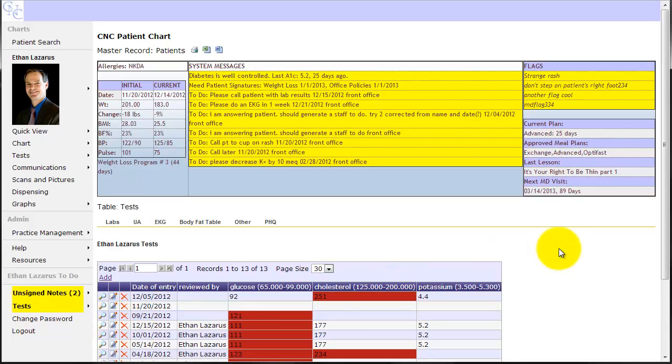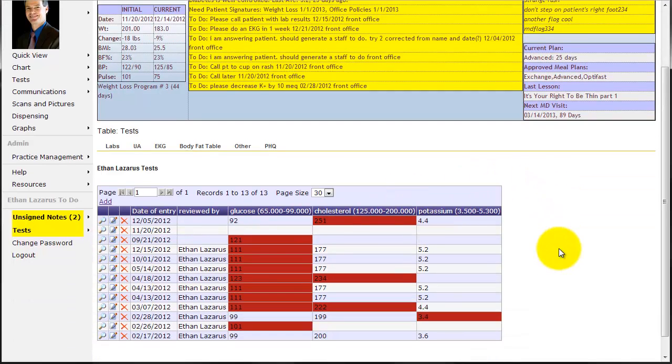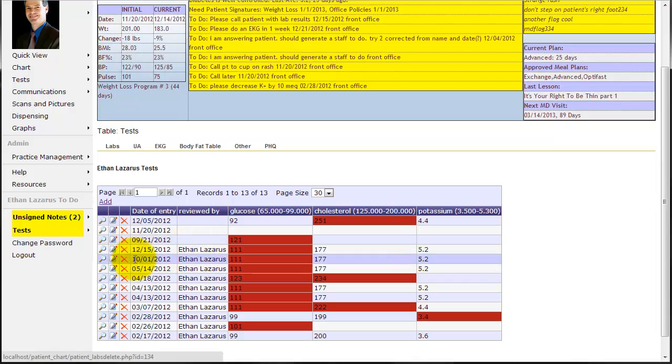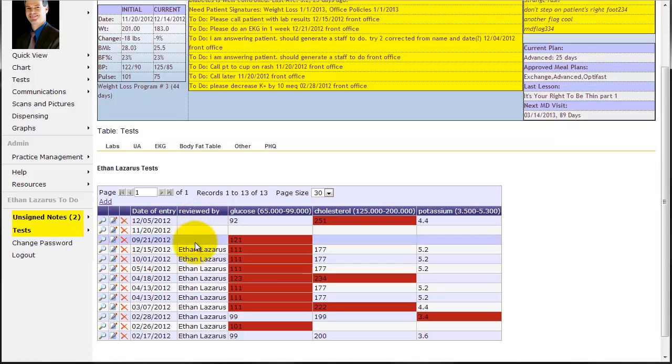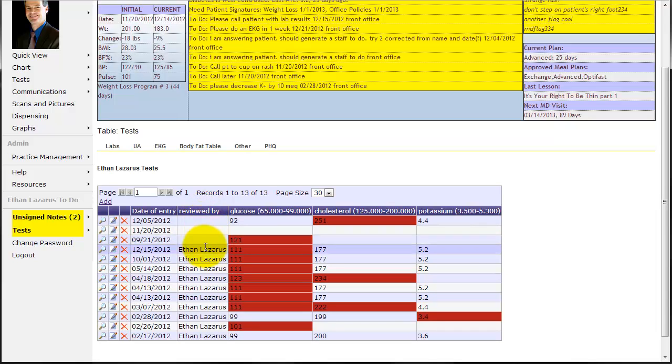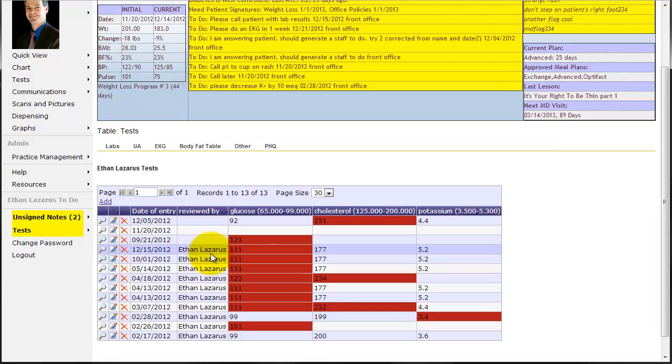Now when I signed off on that, you can see that it moved down below the other labs that haven't been signed off on yet. So anytime you look at a tests table, anything that needs review will be on the top. And then anything that's been reviewed will be below those. So it makes it real easy to find the test that needs to be signed off on.